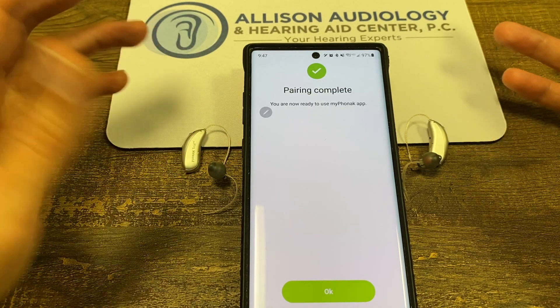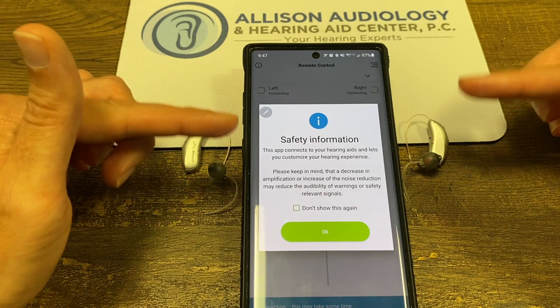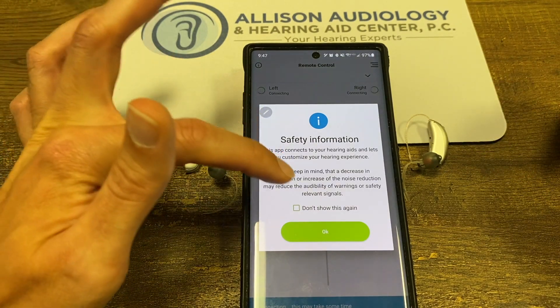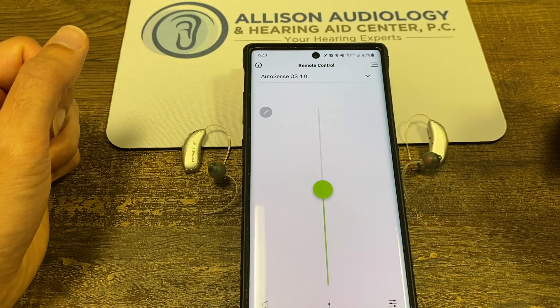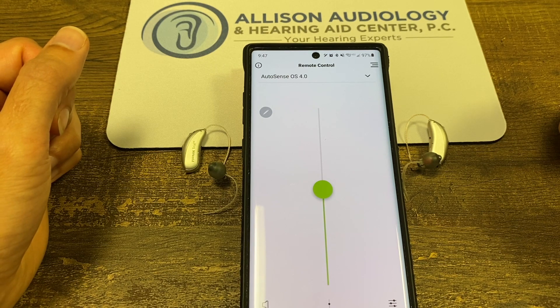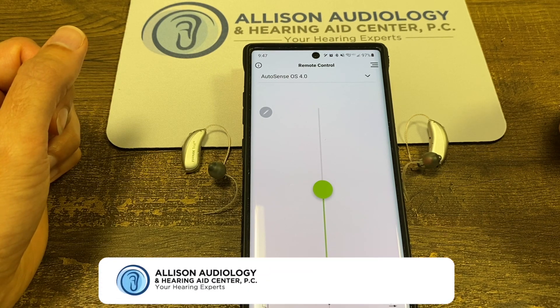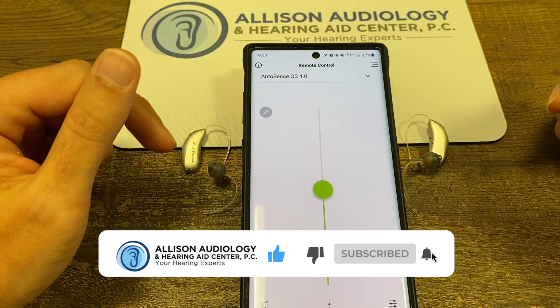Pairing is complete. It's going to tell you about the safety. And we've just connected the hearing aids to the phone and the app, and you are ready to stream phone calls. Through the app, you can use the volume control, among other things. Thank you.